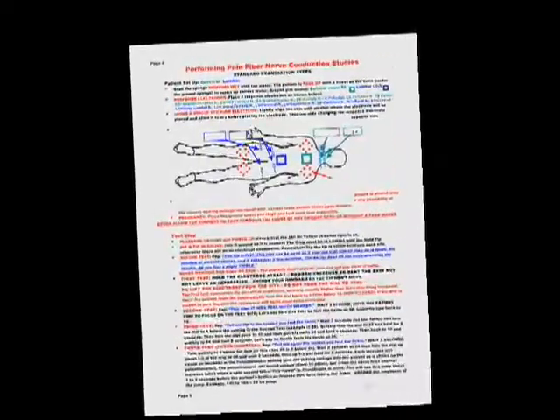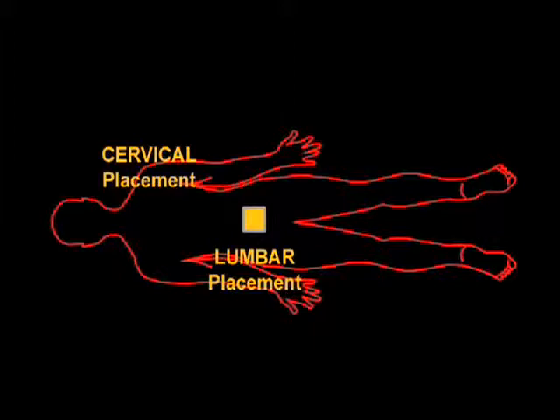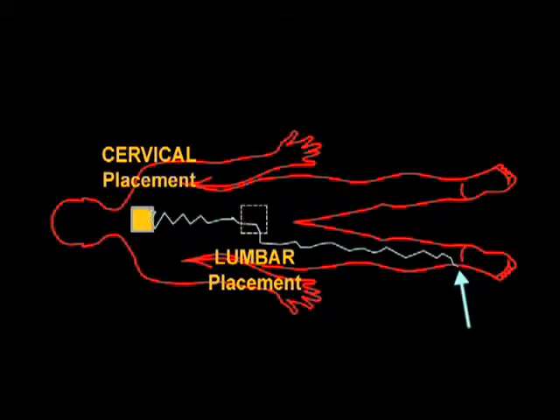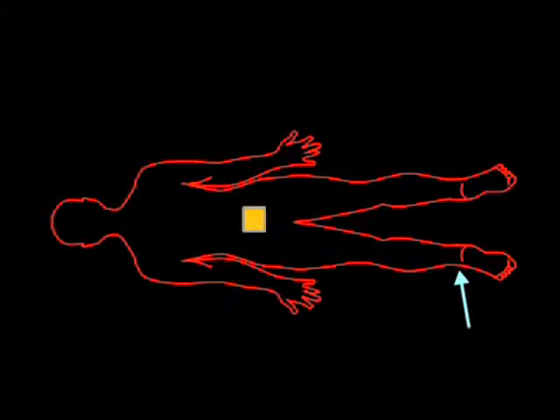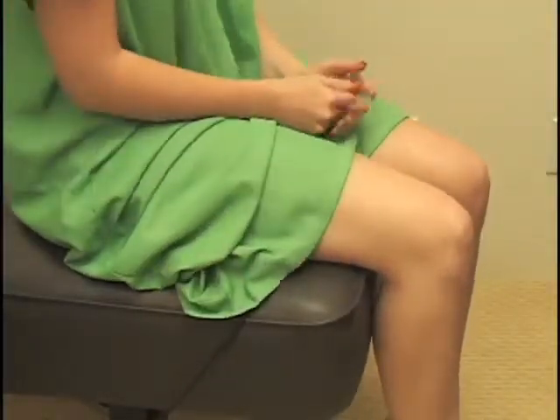Be sure that you are using the correct location for the ground sponge for each plexus tested. For example, if the ground sponge is placed between the shoulders for the cervical exam, but the lumbar exam is performed, the current has to flow a greater distance to the ground, and the patient may not feel the stimulus unless the dial is turned way up. Or he may not feel it at all when testing sites near the feet. Placing the ground sponge closer to the sites tested will assure the current flows, especially through the thicker skin of the lower extremities. While testing the lower extremities, place the ground sponge under the thigh of the side you're testing.